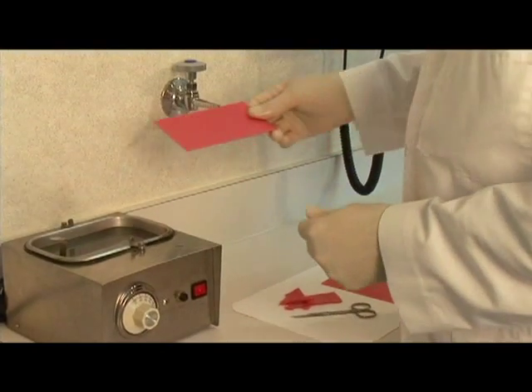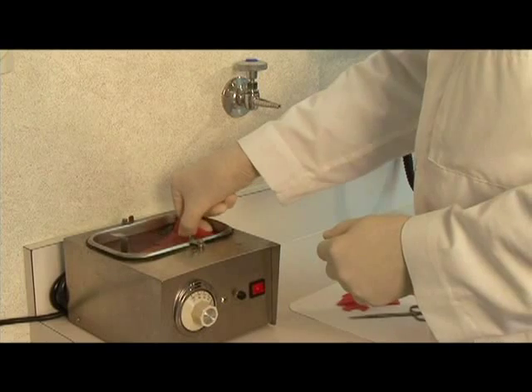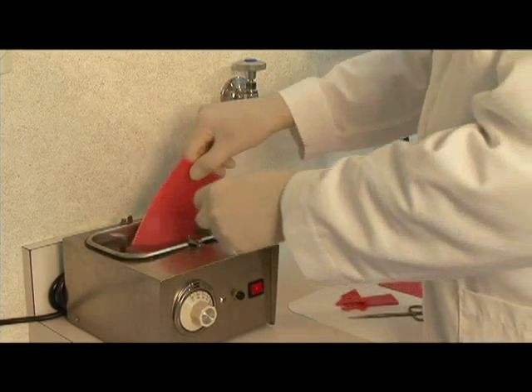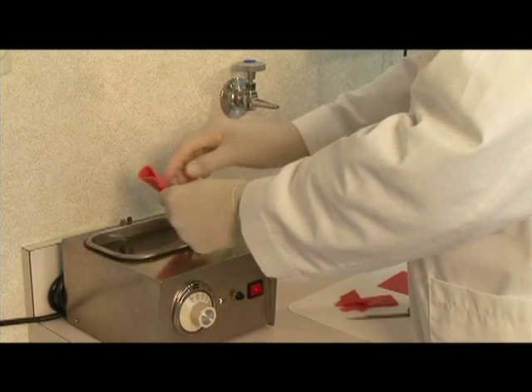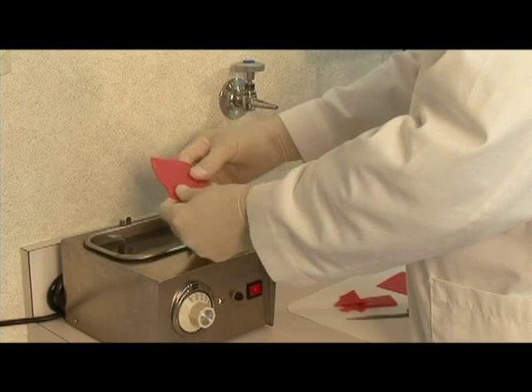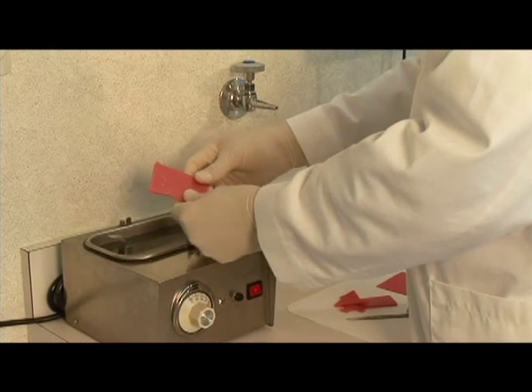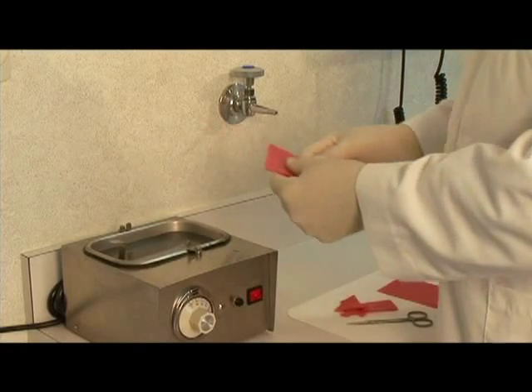When we prepare the wax for the protrusive record, we do it very much in the same manner that we prepared the wax for the interocclusal centric relation record. We again soften the Beauty Pink extra hard wax in the hot water bath at 140 degrees.